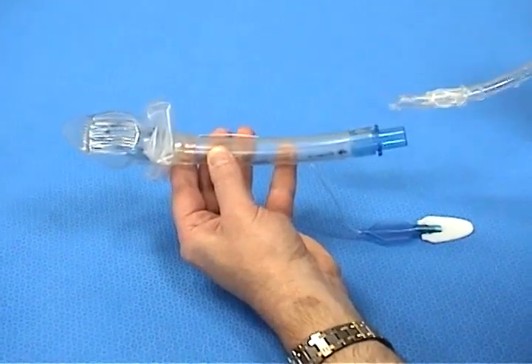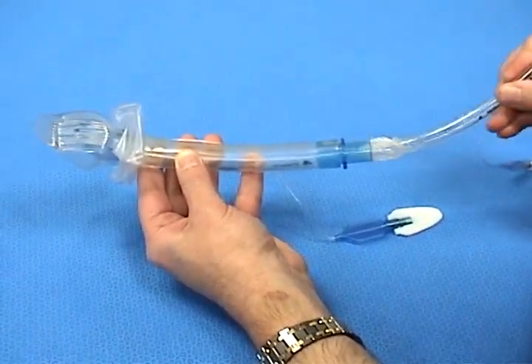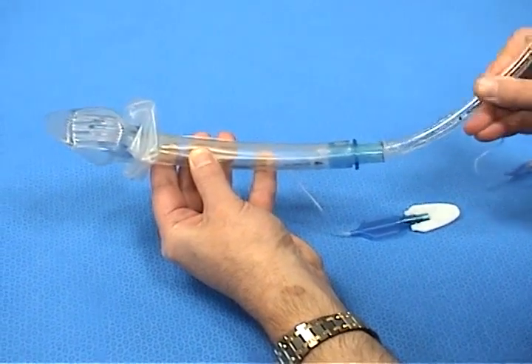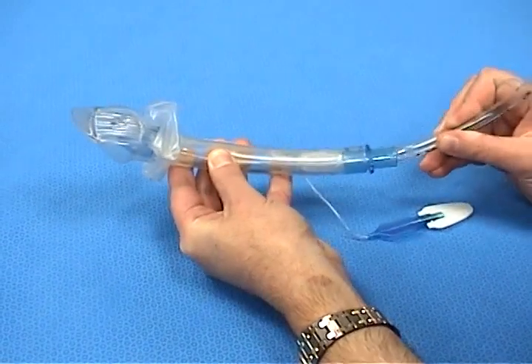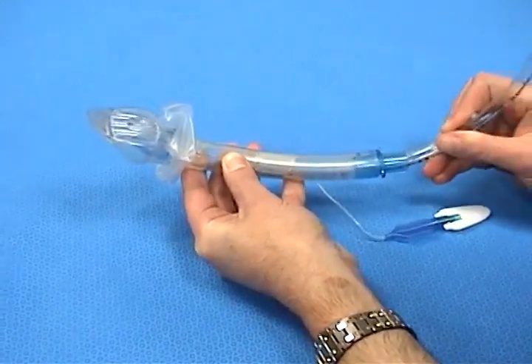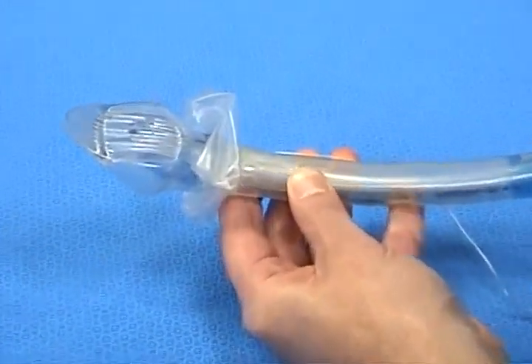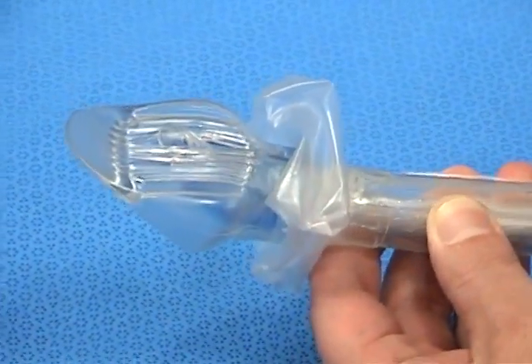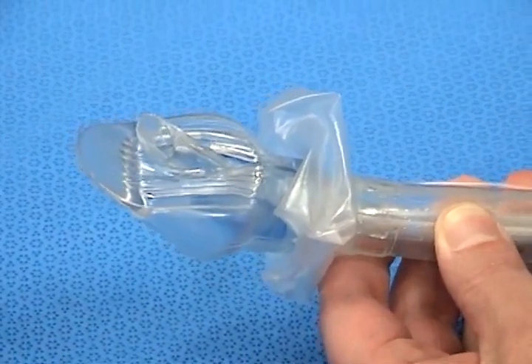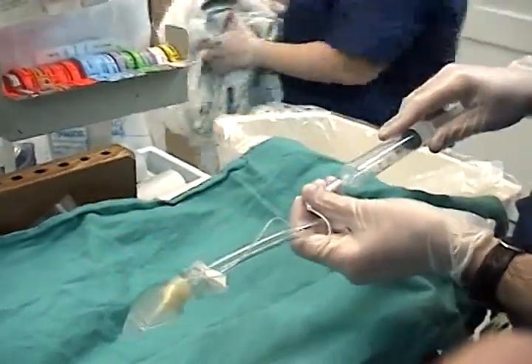Because the Cobra PLA tube is wide, you can easily pass an endotracheal tube through it in the case of an emergency. If this is necessary, the tube should be passed over a bronchoscope. A number 2 or 3 PLA will fit a number 6.5 endotracheal tube, whereas a number 4 or 5 PLA will fit a number 8 endotracheal tube. In this case, we see a number 8 endotracheal tube penetrating the grill of a number 4 PLA. Typically use a number 3 for women and a larger size for men.